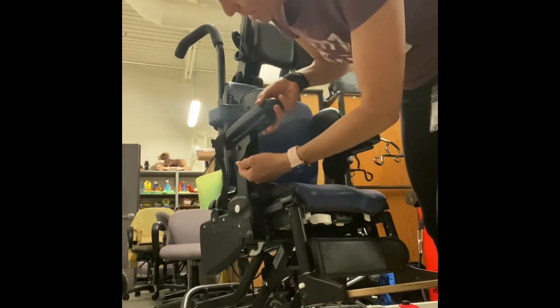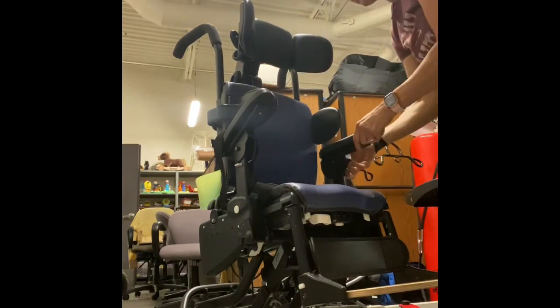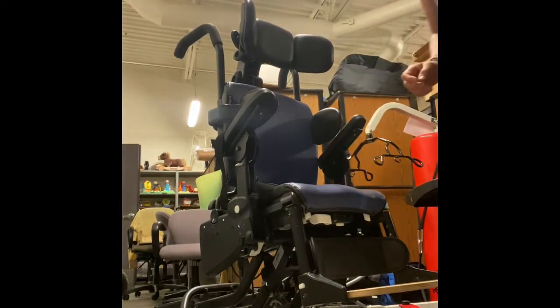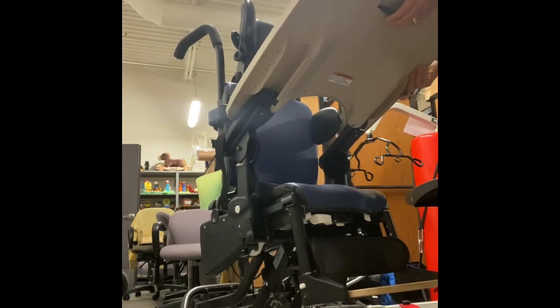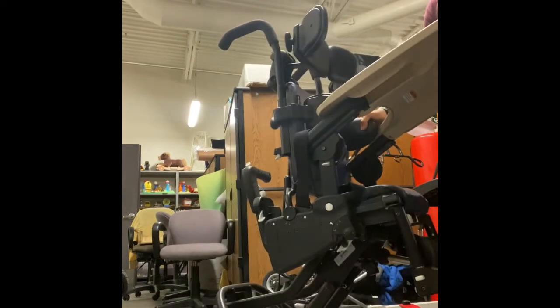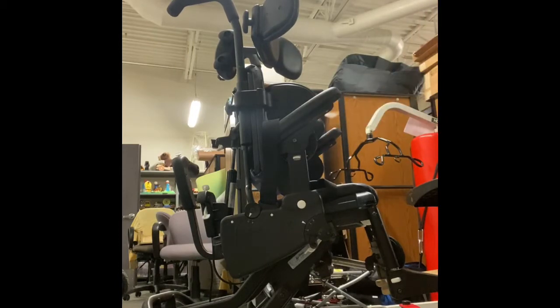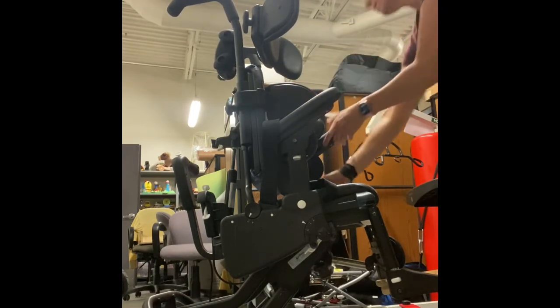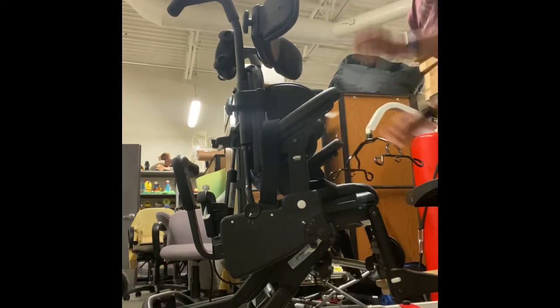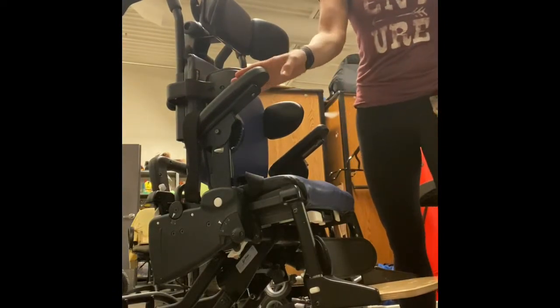Here we have an angle adjuster — this little lever you push up. Some kids need a lot of angle on their armrest so that when we put the tray on we have a nice angle and the child can rest their elbows. Sometimes the lateral might run into this armrest, or it might run into the tray as it goes on, and we have to play with these being at the right spot to accommodate the tray.